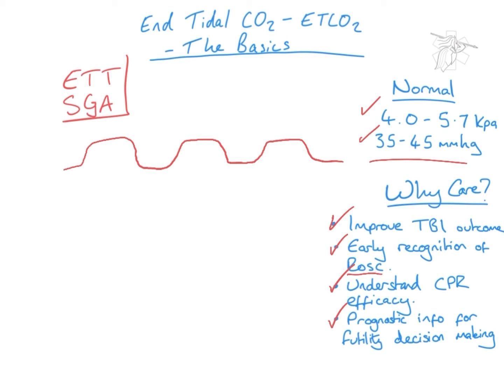You might see a slight variation to this, and this is particular in the cardiac arrest, or if you're managing a ventilated patient following something like an RSI, and you might just get a slight notch in the picture like this. And actually what this means is the patient's trying to take a breath.